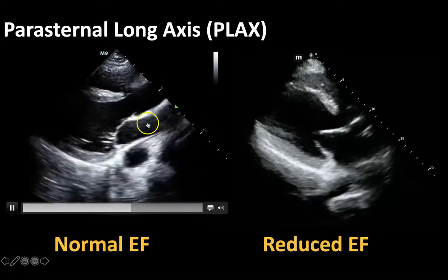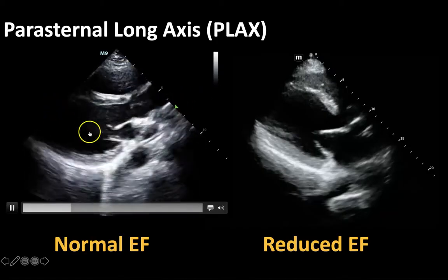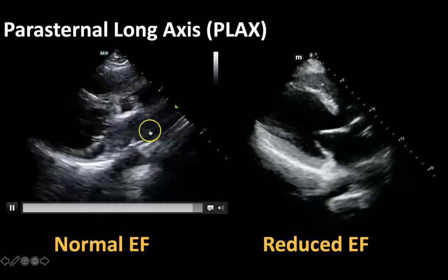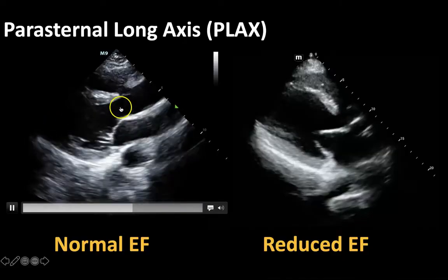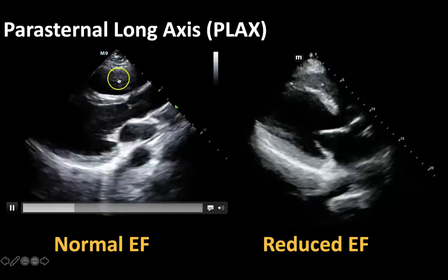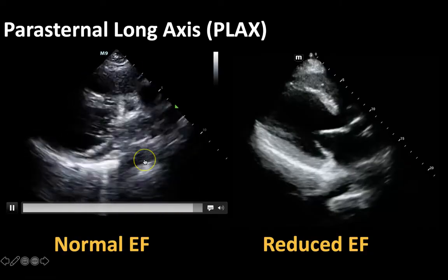So your basic anatomy, so this is the long axis view of the heart kind of cutting across us, so you see most of the chambers in this long axis. So this is your left atrium here, this is your mitral valve, here's your left ventricle here, your aortic valve, and your aortic outflow tract here. Then this most superficial structure is going to be your right ventricle, and back here is your descending aorta.